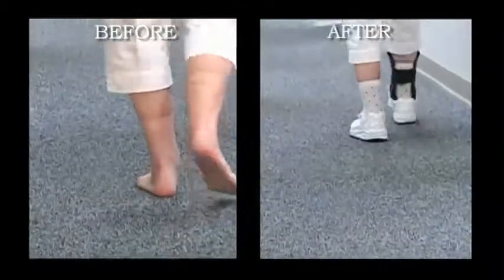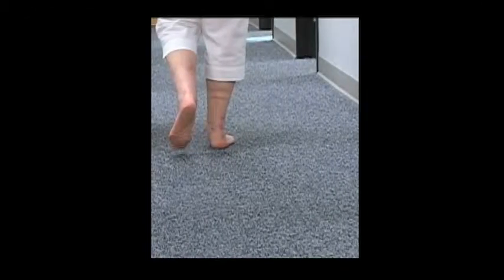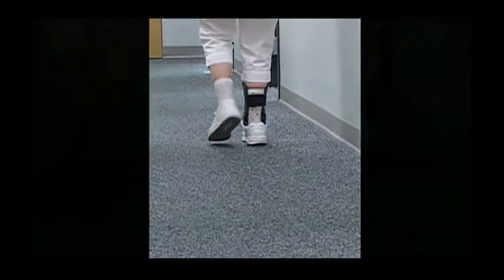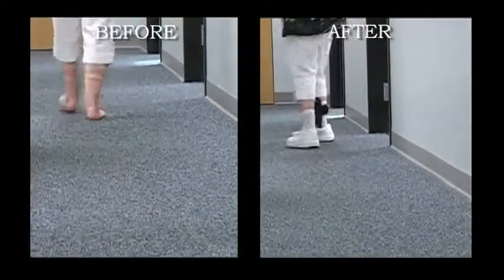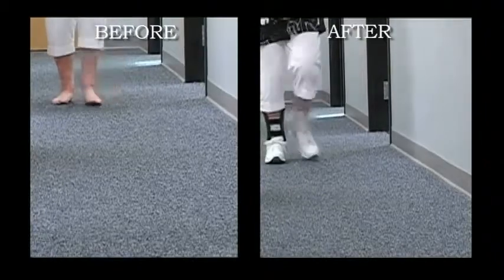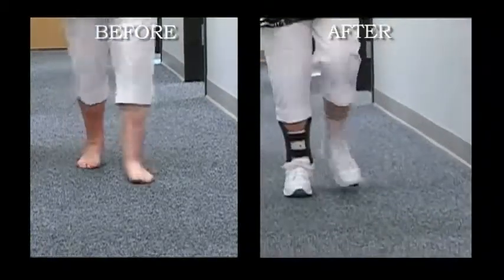A patient with bilateral flat foot deformity but unilateral symptoms is successfully treated with the standard Richie Brace, as well as a custom foot orthosis on the unaffected side. It is also important that proper athletic shoes be worn to help influence the controlling features of the Richie Brace.